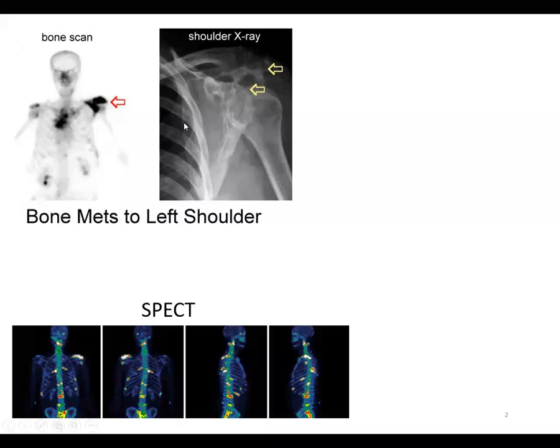Bone scan and X-ray we may name the planar methods of diagnostics. It means that we perform this method in one projection and all organs overlap each other. Then we can perform an image in the second projection, and again all organs may overlap each other. In case of SPECT, we may also achieve planar imaging, but we can also achieve cross-sectional imaging in three projections, axial, sagittal, and coronal, in order to receive more precise imaging information slice by slice.